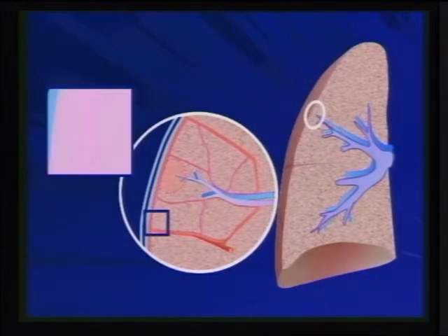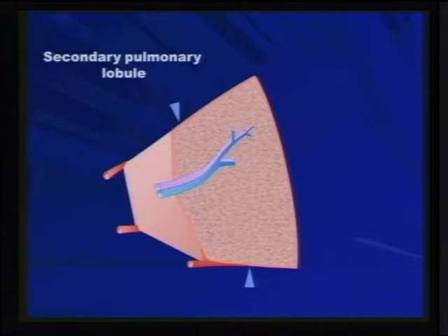However, when you go beyond the acini, the CT scans, at least today's scanners, cannot resolve the detail of the terminal bronchioles. And that's something that I need to emphasize. So really the basic structure that you need to recognize is the secondary pulmonary lobule. And if you're lucky to identify what happens within the confines of the secondary pulmonary lobule, i.e. the acinus, then you'll be able to detect early or minimal disease.